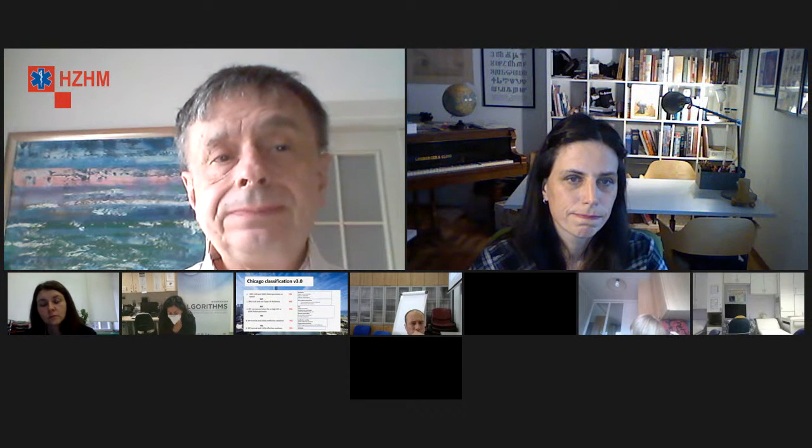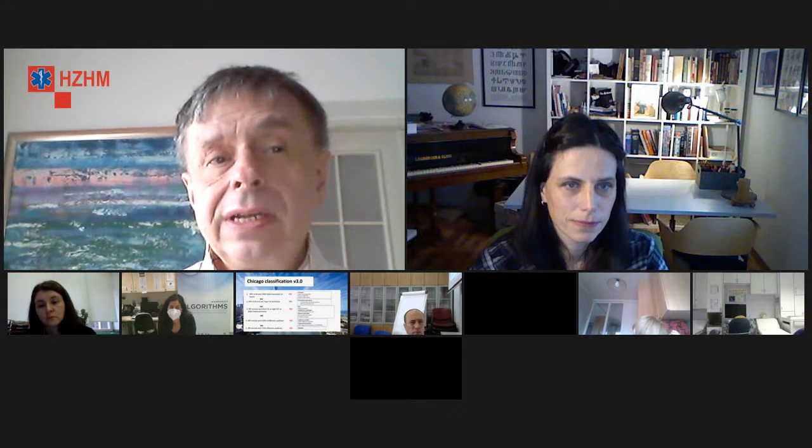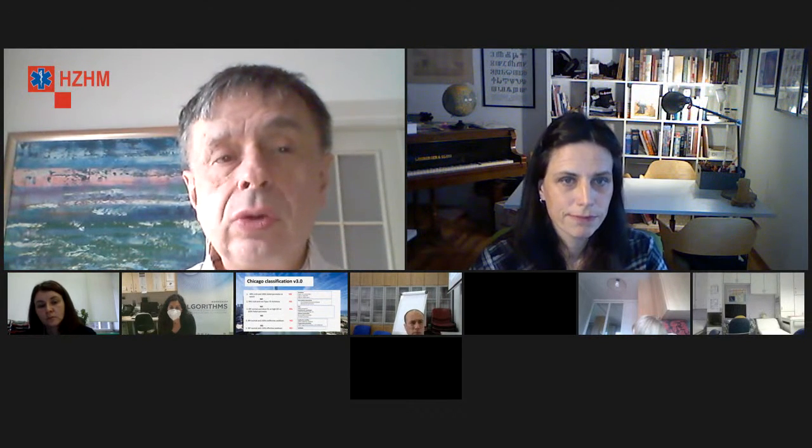Otišao je na stavljanje balona oko jednjaka kako bi se povećao tlak. Desilo se ono što sam i predvidio, da sadržaj više ne može prolaziti kroz jednjak. Sad je pitanje, nakon 23.000 eura plaćenih u Beču, da li taj balon vaditi van i što s njim napraviti. Evo, dakle, to su stvari gdje se slušalo robota.